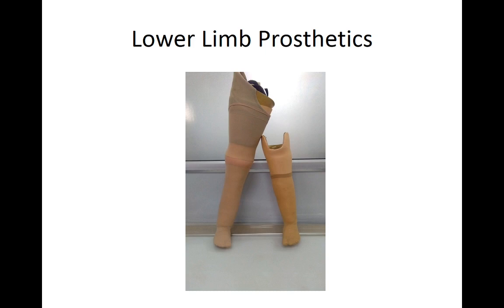Now, coming to the care of the prosthesis, because I haven't prepared more slides. When a patient uses a prosthesis, lots of sweating will be there. Sometimes the patient doesn't take care and infection might recur. So it's very important to counsel the patient on the care of the prosthesis and the limb.